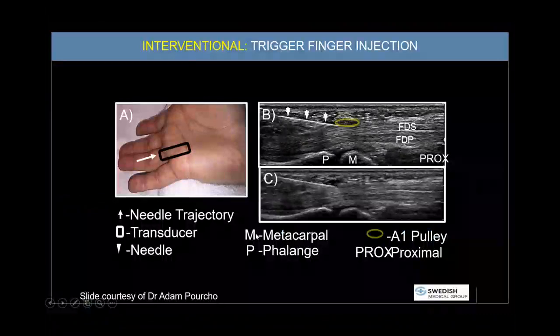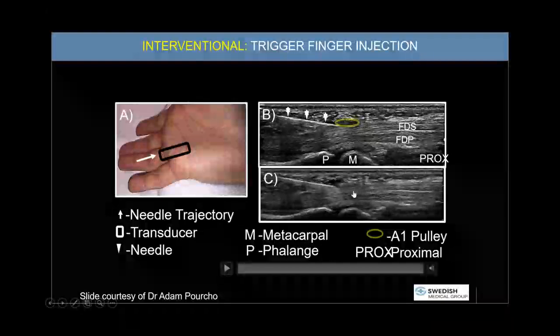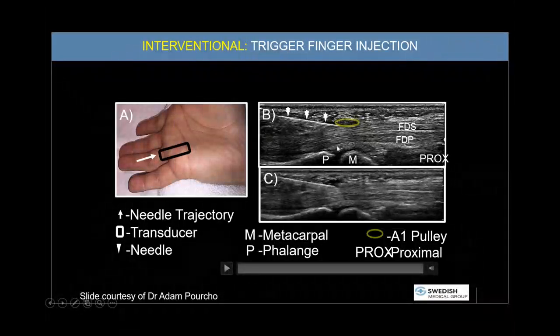Again, as we advance with our skill and knowledge and higher end machines, we're able to do more things. So here's some pictures of the injection being performed, a little video here showing proper needle placement and then injection of the solution around it.